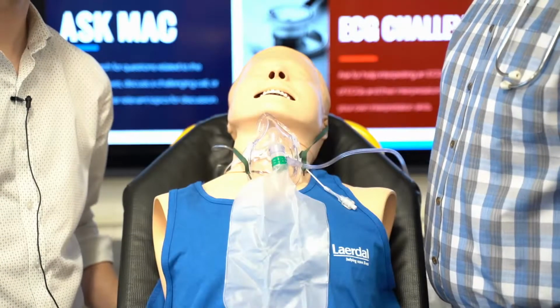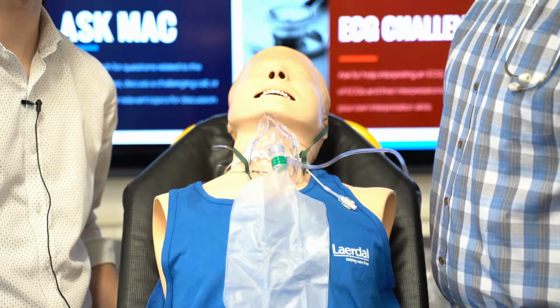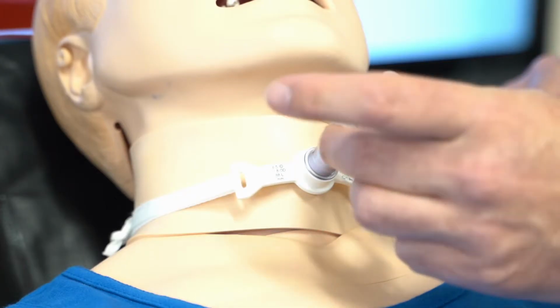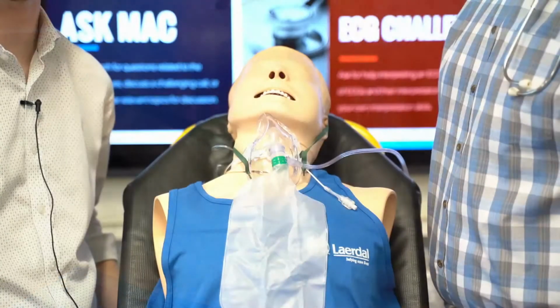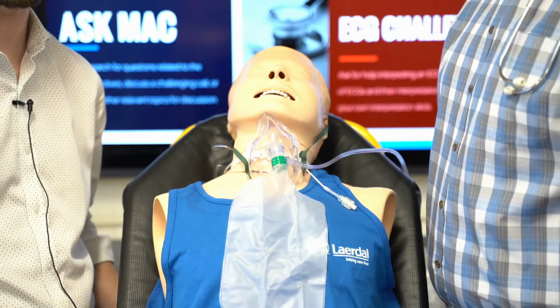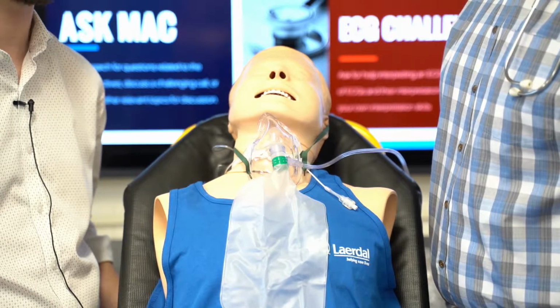When using our emergency flowchart, we bypassed our first section and now we're moving on to oxygenation. You can see our patient here has a tracheostomy in place and we have our end tidal and non-rebreather in place. That's because we have one source of oxygen at this time. The preferred method would be to use two sources of oxygen if possible, but that may only be available when you get into the back of your truck.